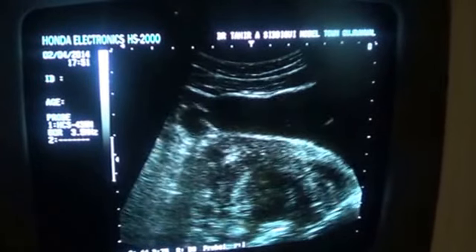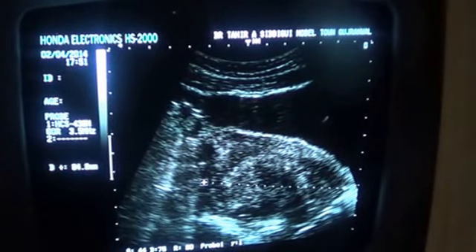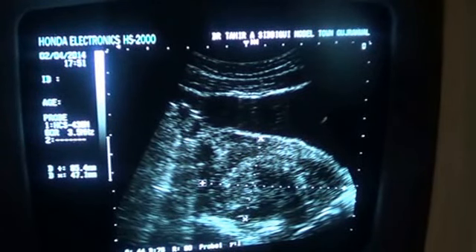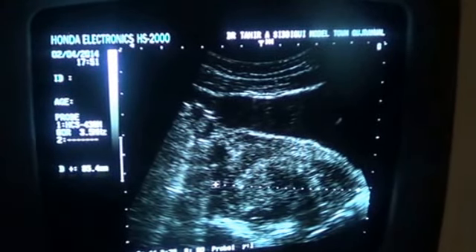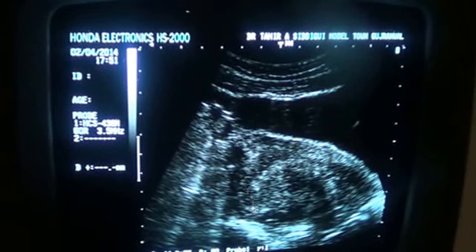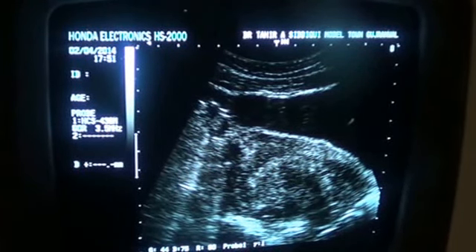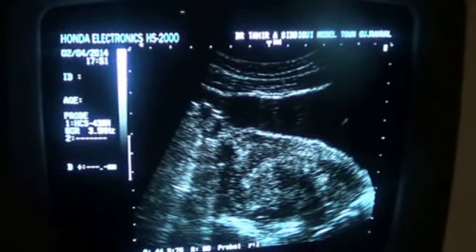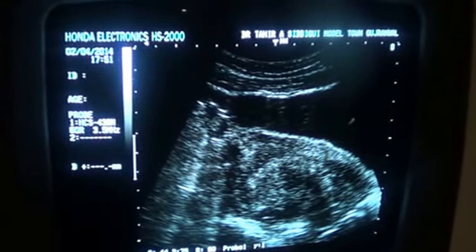Now you see this is the uterus, the outline of the uterus, measuring 8.5 by 4.7. This is a relatively enlarged size for a nulliparous woman. Now this is the anterior myometrium. This is the posterior one, in which you are seeing black focal lesions that are fibroids, small fibroids. This is the cervical canal. This is the cervix, and this central echogenic area is representative of the endometrial canal.